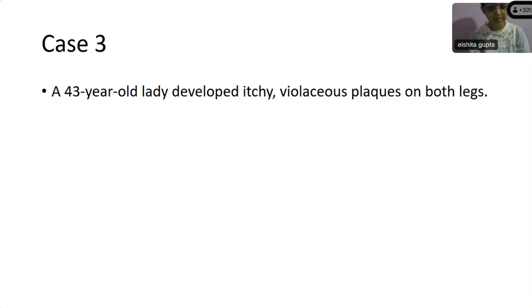Okay, thank you. So case 3, can I ask Jhansi to take this case? Yes, ma'am. Jhansi, are you there? Yes. So this is a 43-year-old lady with itchy violaceous plaques on both the legs.